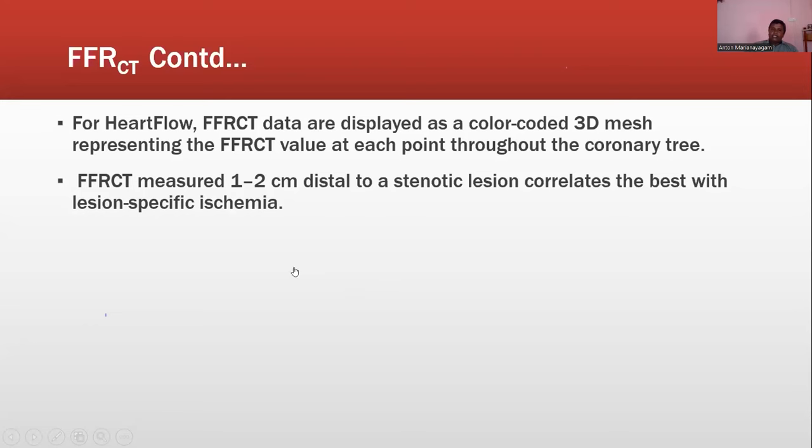Now they are trying to find different ways to circumvent these tricky calculations so that our own computers can be adapted to create these models. And FFRCT should be measured distal to the stenotic lesion, and it correlates best with lesion-specific ischemia.